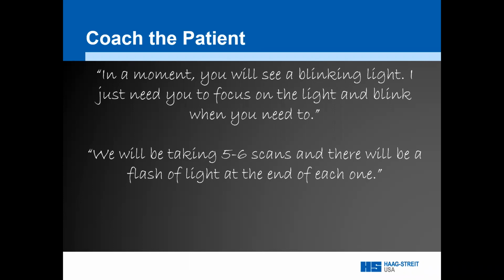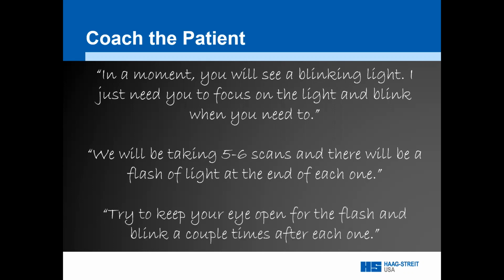That way the patient expects the flash and will be less likely to jump out of the chin rest and sit back. The last thing I like to say before adjusting the patient is try to keep your eye open for the flash and blink a couple of times after each one. During that flash of light, the Lenstar is obtaining the white to white measurement. So if the patient blinks every time the flash occurs, it will be very difficult to obtain the white to white reading.